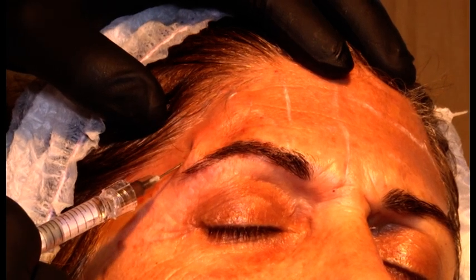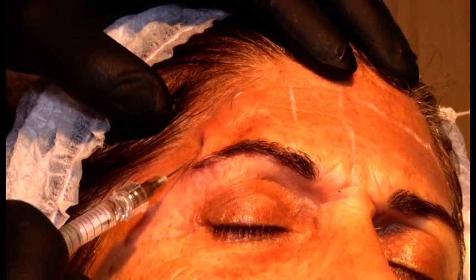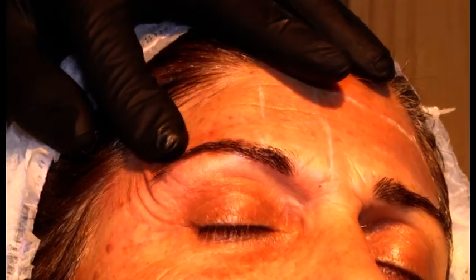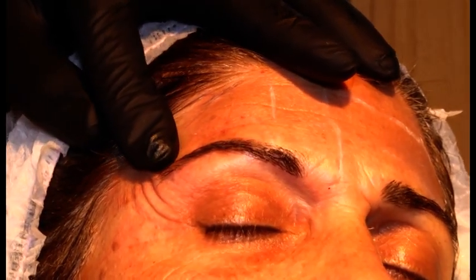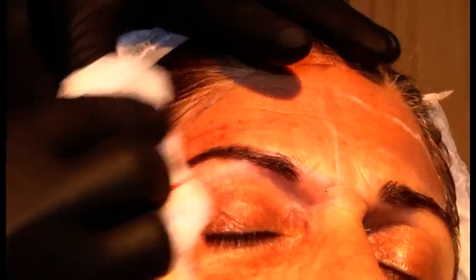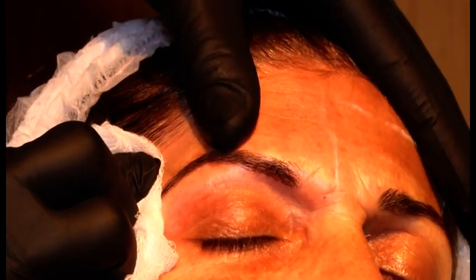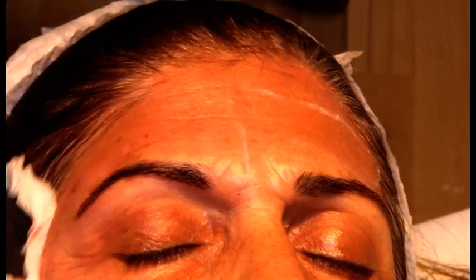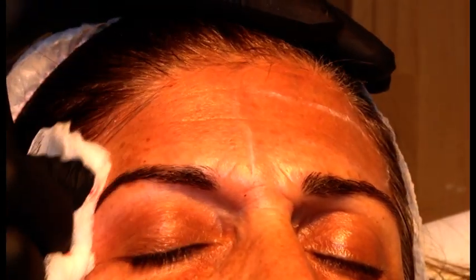So I'm injecting lots of very small deposits. You see a little bump over here. I will even it out. So as you can see, it's becoming nice and smooth already right here. You see that?